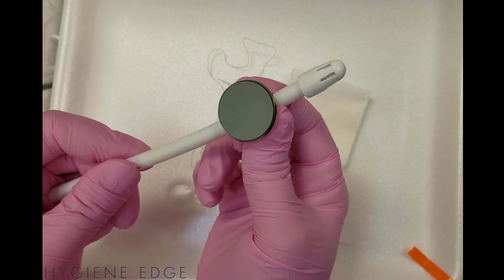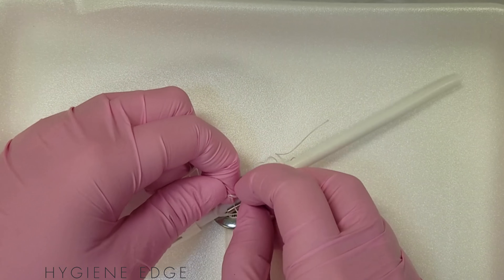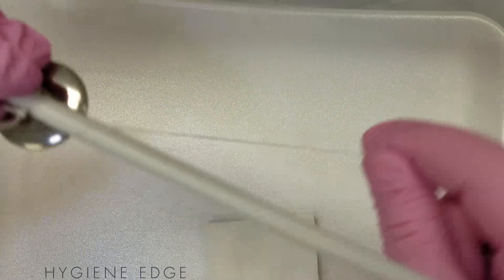To use it, gently squeeze it around your slow speed suction like so, and you can even move the mirror up and down on the suction as needed. There are also built-in safety loops for you to be able to ligate the mirror as needed, as an added precaution for compromised patients.